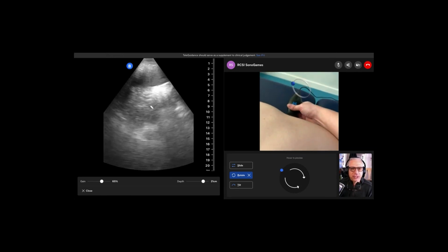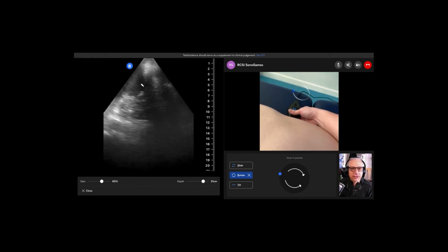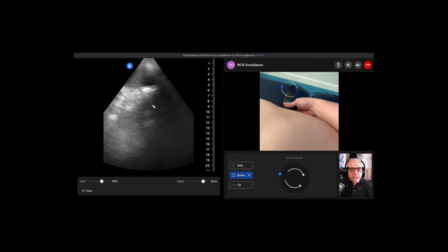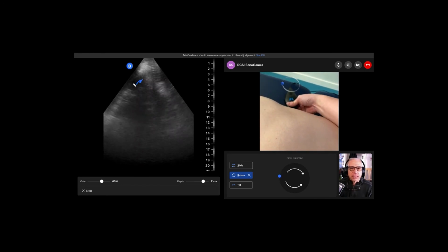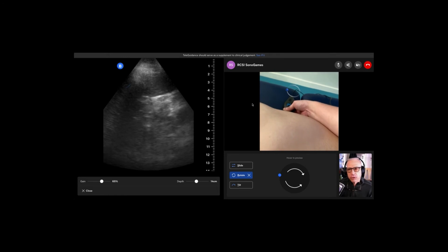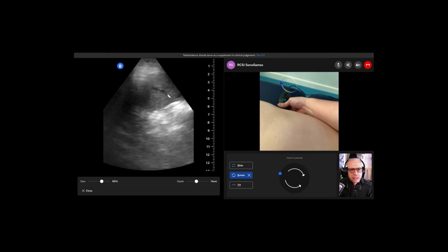It's always as soon as you take your eye off the picture, it looks there. So there's spleen, and his kidney is right in here someplace. So just mess around a little bit. You'll get it. Right. So there's spleen. You see that up here? That nice homogeneous tissue. Maybe a little more shallow. So if your spleen is here, you want to slide a little more up towards the head. There it comes. See that? Oh, okay.